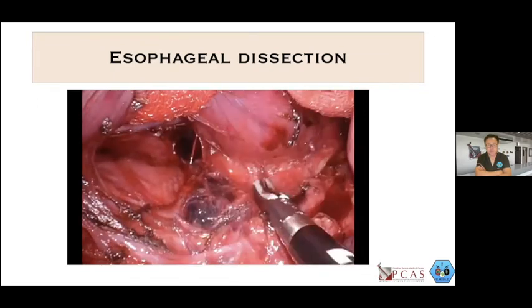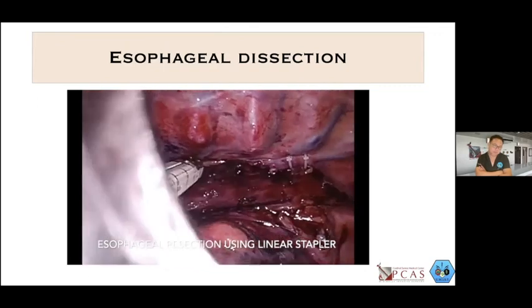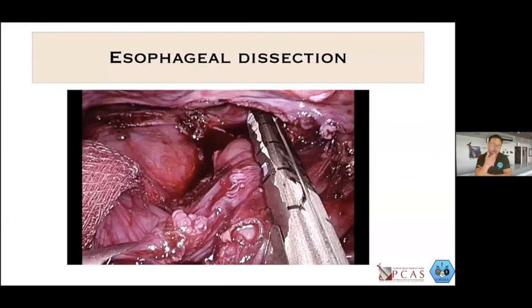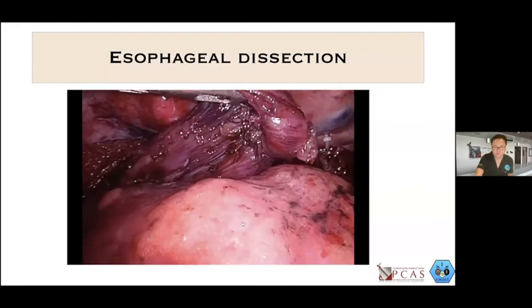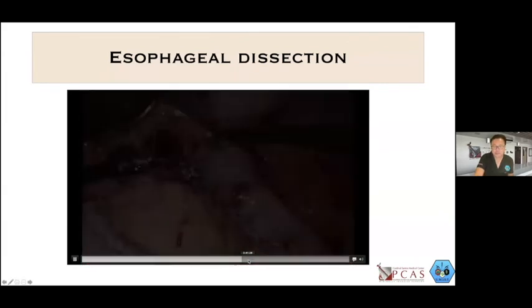Transection of that mid-esophagus can be done using your stapler, and bringing up that stomach for you to be able to do your esophageal reconstruction.